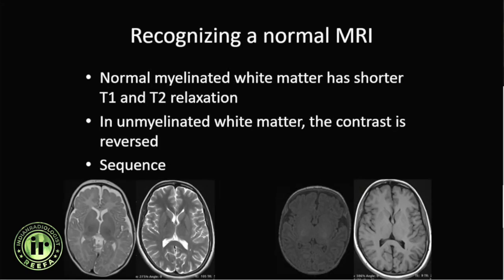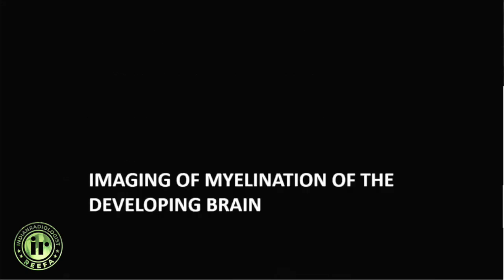First, it is most important to learn how to recognize a normal MRI. The T2 and T1 images shown represent a normal myelinated adult brain. In an unmyelinated brain, the challenge is that this contrast is reversed, and because of the abnormal hyperintense signal in the white matter, we may mistake the normally unmyelinated white matter for some abnormal metabolic disorder.